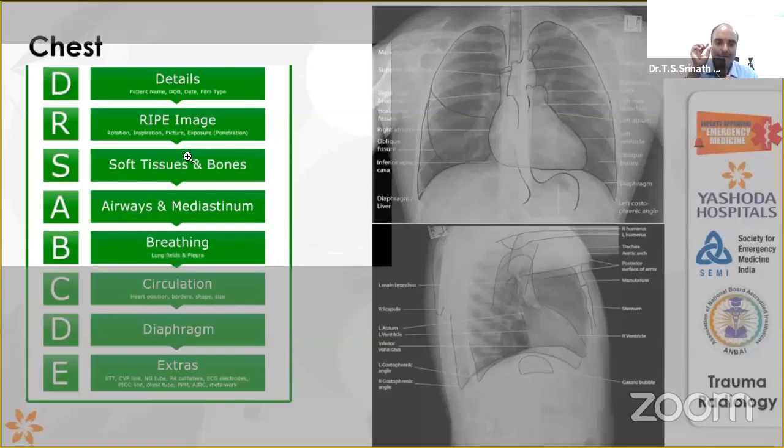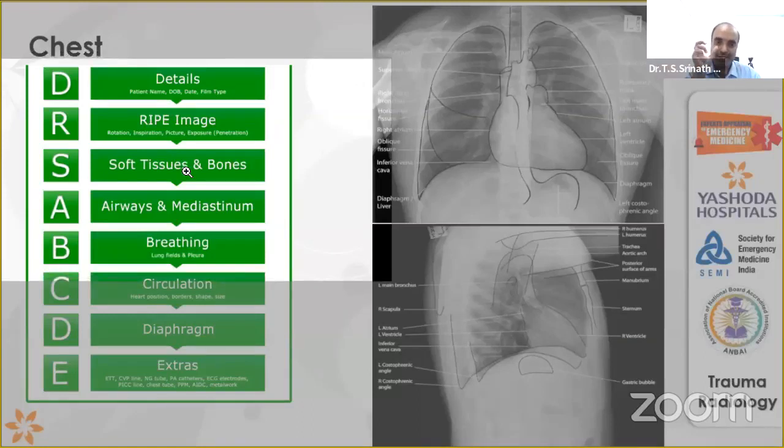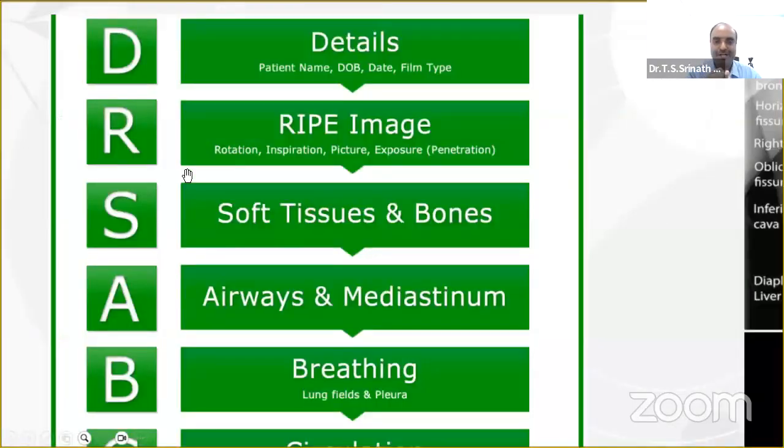I'll write and give you, because documentation will always be kept in your mind. You will never forget: this is this patient's X-ray. Is it a PA view or AP view? How is the soft tissue looking? How are the lung fields looking? How is the heart looking? How are the thoracic vertebrae looking? Where is the endotracheal tube placed?